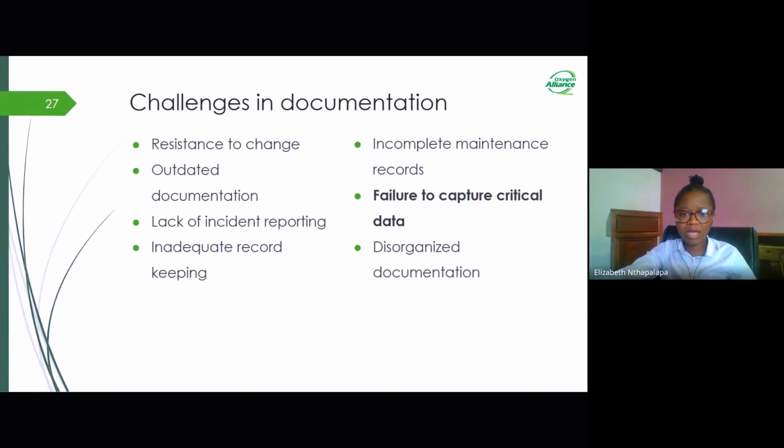But because it is hard to access, for example, from an oxygen concentrator, let's say the ones that just show oxygen concentrator, it is hard for you to get information like the brand, the model, and even other important information that needs to be recorded in the maintenance workshop. So this one is also a challenge as it is crucial in the usage of that machine.